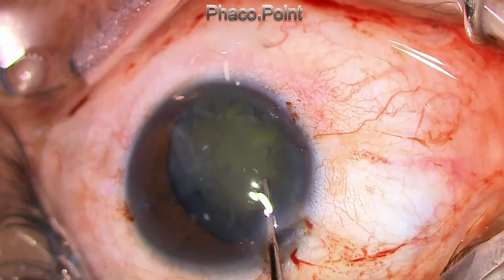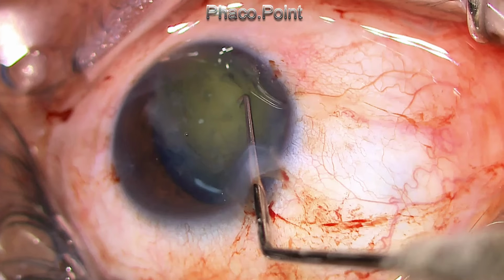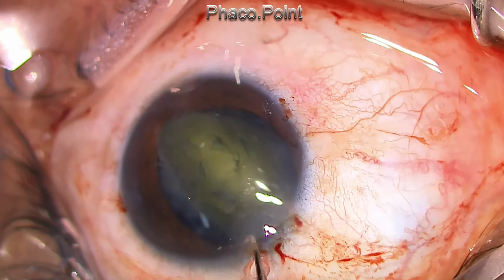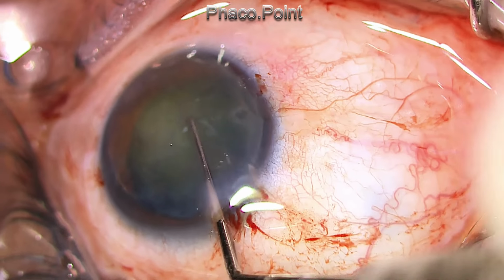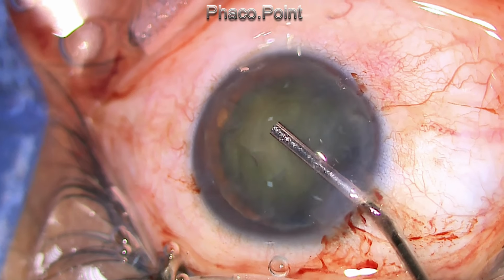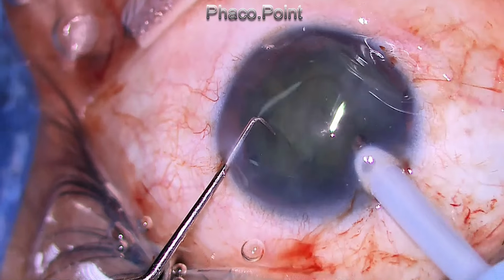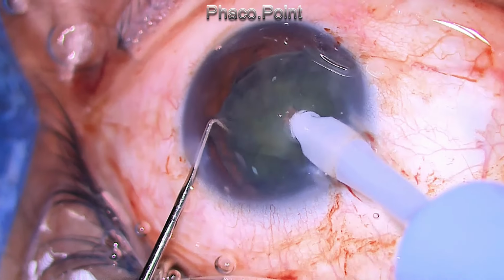Nucleus management was much simpler when I got this nucleus out of the capsular bag by simply rotating it into the anterior chamber, and then I put viscoelastic between the endothelium and the anterior surface of the lens. Using predominantly vacuum with very low phaco power settings of just 20%, giving short bursts of phaco but mostly vacuum, I was able to get the entire nucleus out. The rest of the procedure went quite uneventfully.